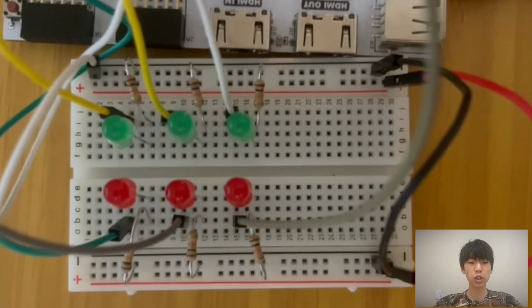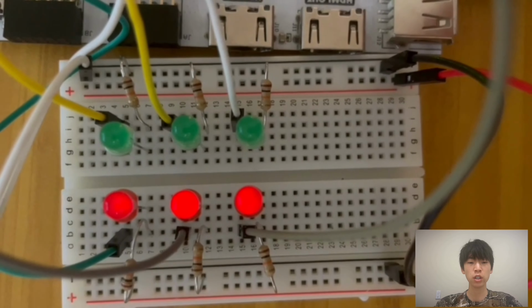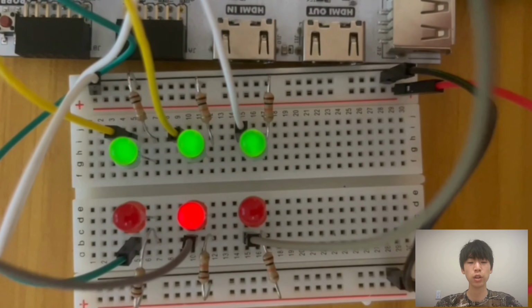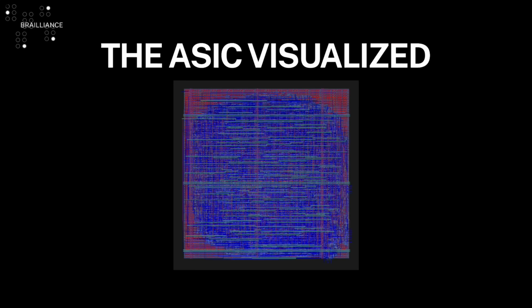For the sake of the simulations, we will use LEDs and FPGAs, programmable chips loaded with our HDL code to demonstrate our process. ASICs require a lengthy development process that isn't attainable within our program, leaving FPGAs as the next best option. And here is our ASIC. With the massive amount of transistors, it comes out to be 400 microns by 400 microns.